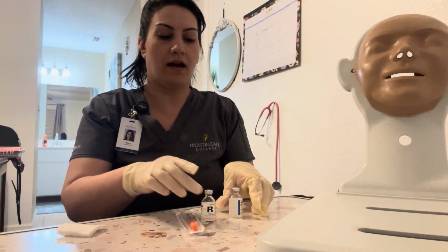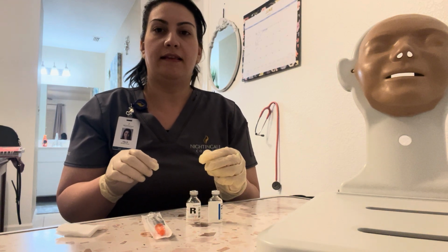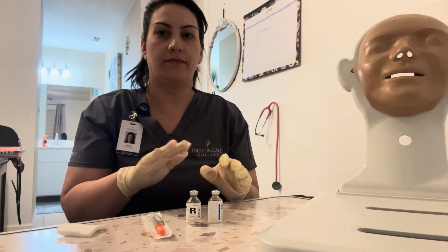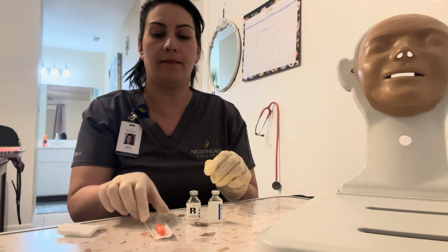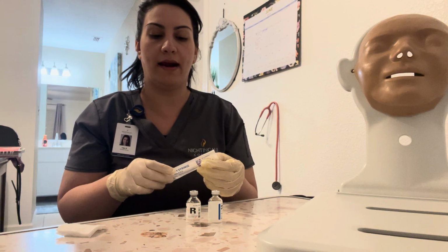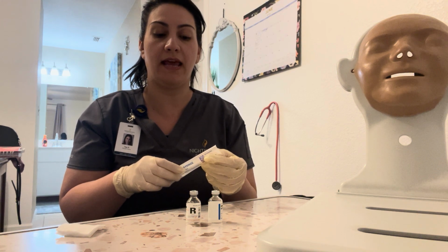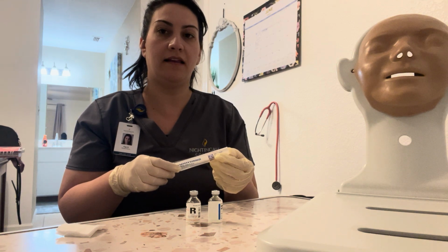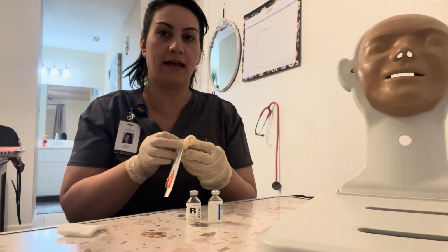I'm going to start off with my NPH. I'm going to get the air, and I will inject the air and not drop any solution. And then I'm going to go ahead and inject the air of the regular, and I will draw up the 4 units, and then I will go ahead and draw the rest of the NPH. And that will equalize 12 units of insulin, and then the nurse and I will confirm individually to make sure that it is good against the MAR.